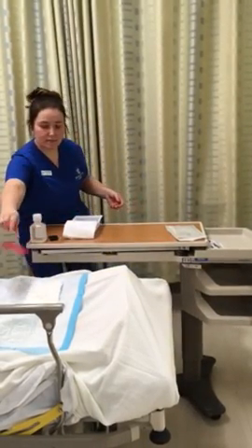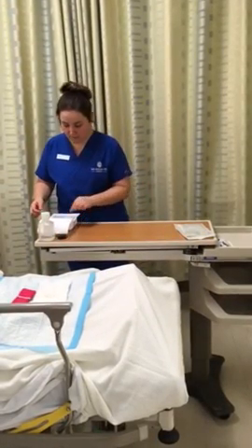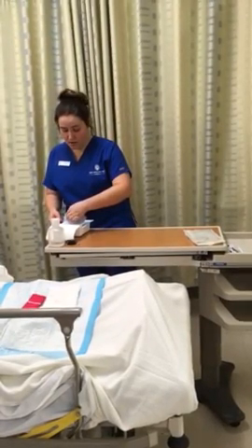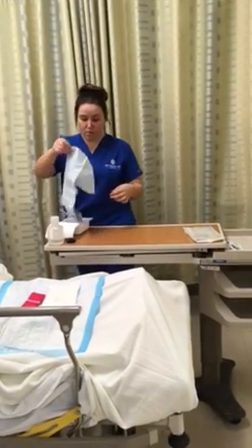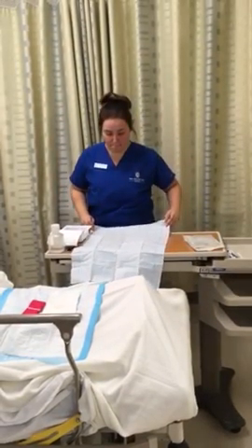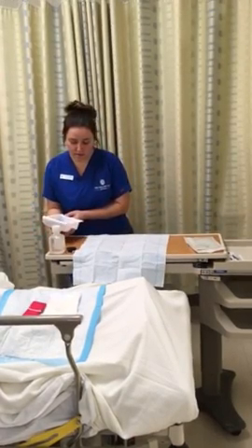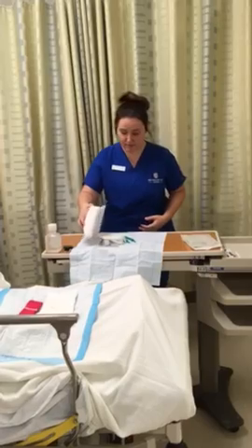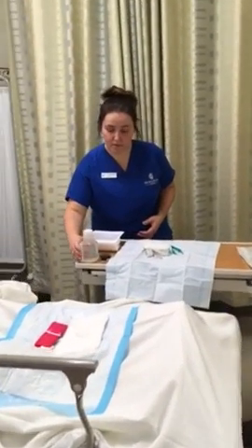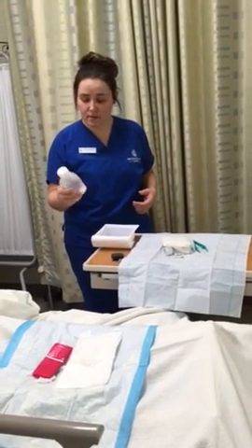And I won't be needing that, so I'll discard that. And acknowledging that I have a 1-inch border. And now I'll discard the contents onto my sterile field. I have a bottle of normal saline. I'm going to ensure that it has not been opened in the last 24 hours.